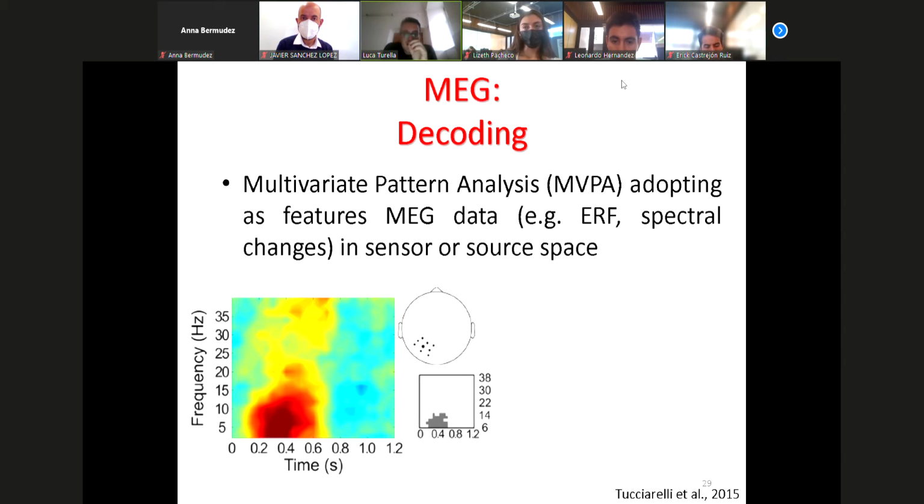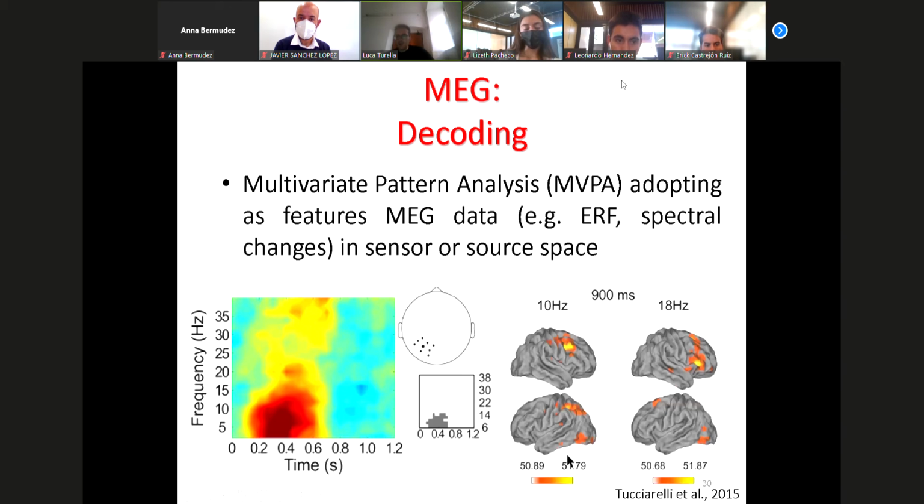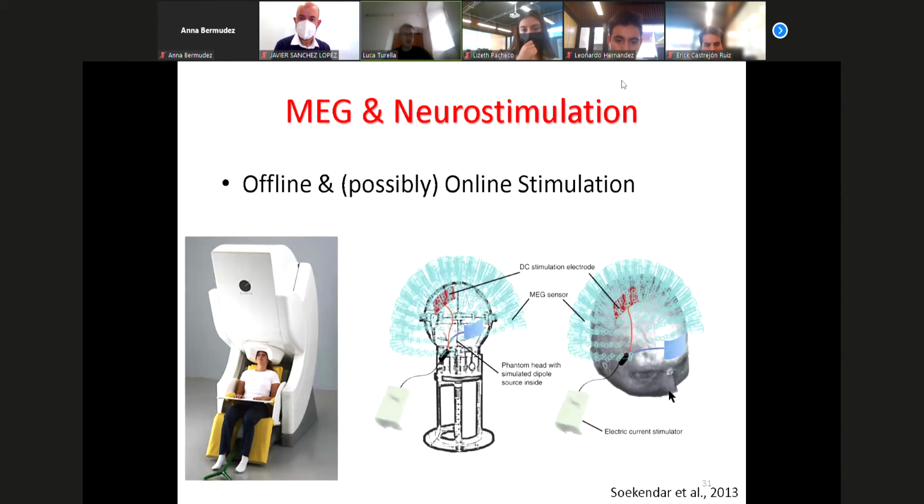Whereas studies using, for example, EEG and MEG have started unveiling how this type of information might be represented during this delay and have provided novel evidence about how the brain might represent this type of information. Again, you don't do this kind of advanced multivariate analysis at the sensor level only, but you can also see where this type of information might be represented, again, with source analysis.